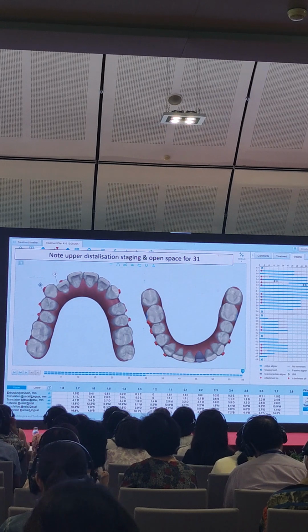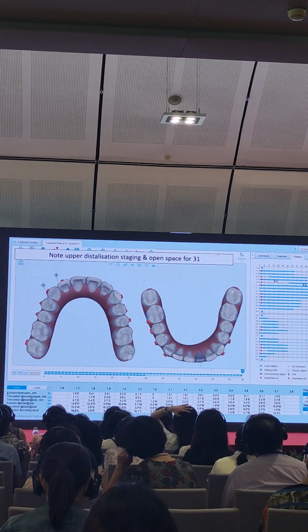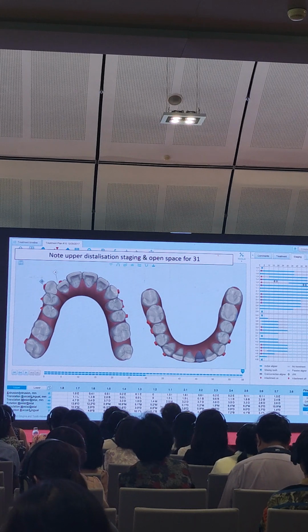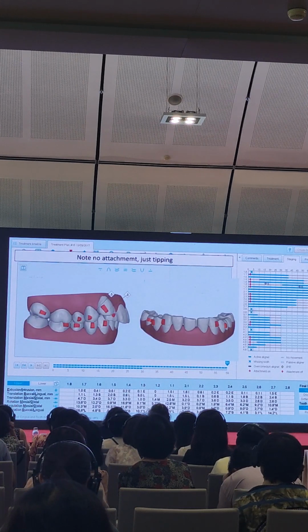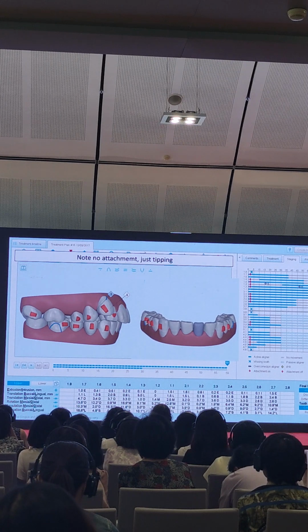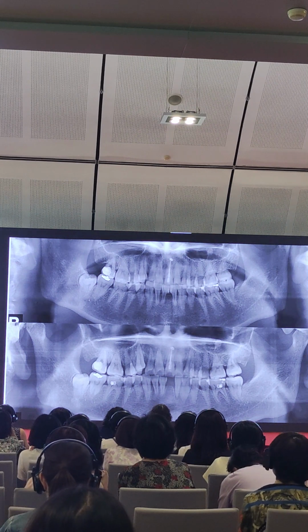If this is a simple treatment, we don't need any attachment. The tooth itself is the biggest attachment. Okay. When you put an attachment, make sure it's useful, no matter whether it's for controlling tooth movement or to give you retention. But if an attachment is not fitting, it creates more trouble. So that is how we did it. And finally we removed all the composite between the 4-1 and 3-2, and now we got the teeth parallel.